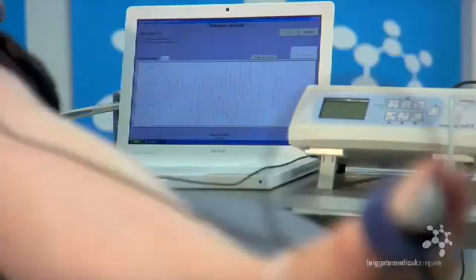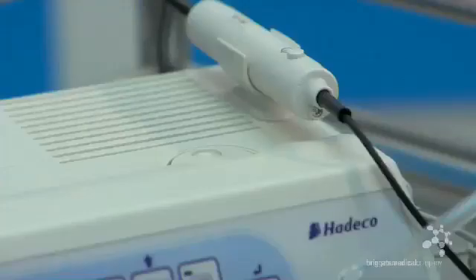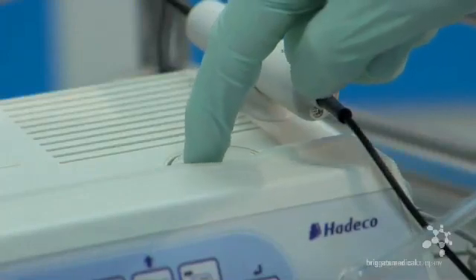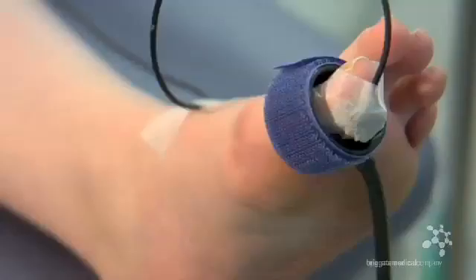The machine is now ready to automatically obtain a toe pressure. Due to the sensitivity of the PPG probe, we suggest that you observe the patient closely and make sure that they remain calm during this brief period. Any movement of the foot can affect the pressure reading. Because this is now an automatic process controlled by the machine, we suggest you turn the sound volume off so that the patient is not aware of their pulse rate.